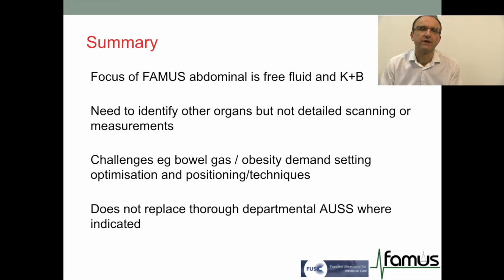In conclusion, the aims of a focused abdominal study are, on one side, identifying the presence of free intra-abdominal fluid and potentially a site where to drain this fluid, and to identify the presence of hydronephrosis in patients with acute kidney injury.